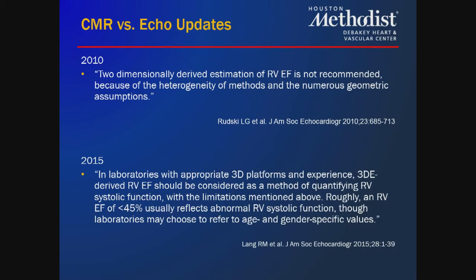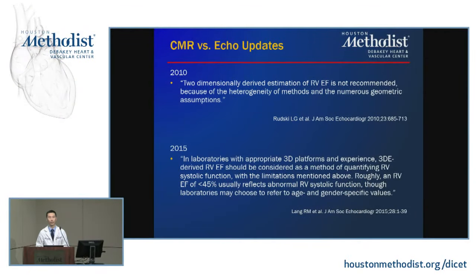Well, it used to be that echo, being mainly a 2D technology in the past, wasn't recommended for estimating RV systolic function, that is, RV ejection fraction. That being said, things are catching up on the echo side. There are now 3D techniques coming out with echo, and the latest chamber guidelines back in 2015 from the American Society of Echo did comment that 3D echo may be considered, but there needs to be further research and validation.